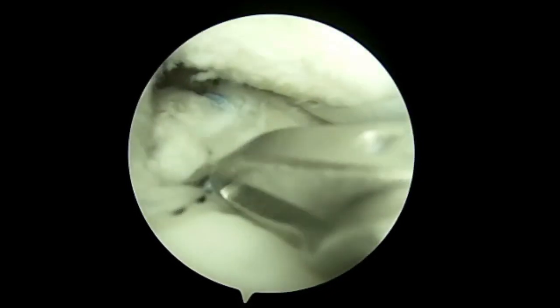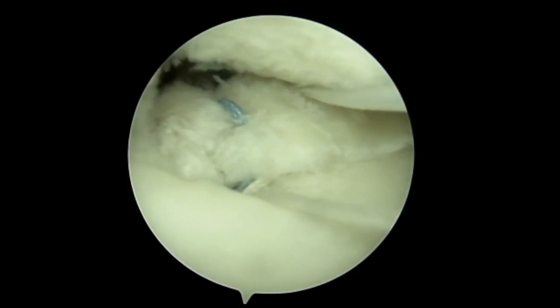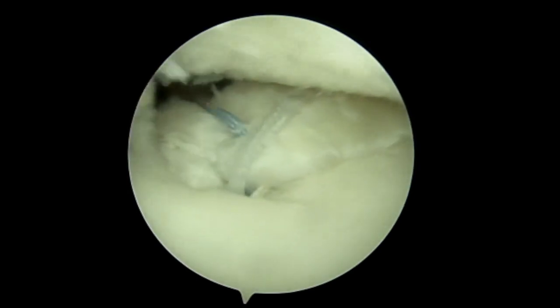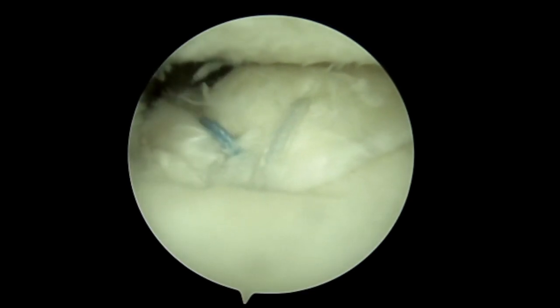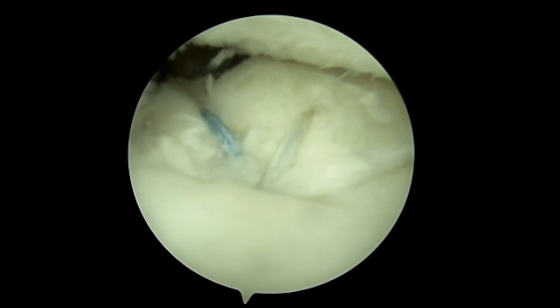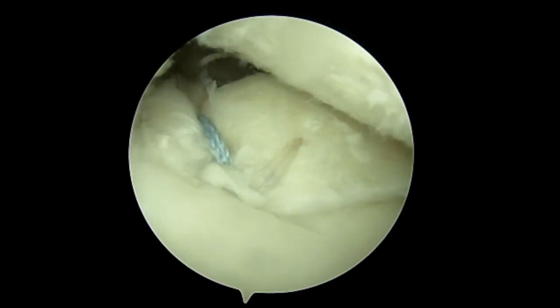The black-white conversion suture is used to pull the solid white suture down into the tibial tunnel. The solid blue and solid white sutures are tensioned gradually to reduce the meniscus to its insertion. This can be repeated multiple times or after cycling the knee, and one should note that significant tension can be created using this direct fixation.